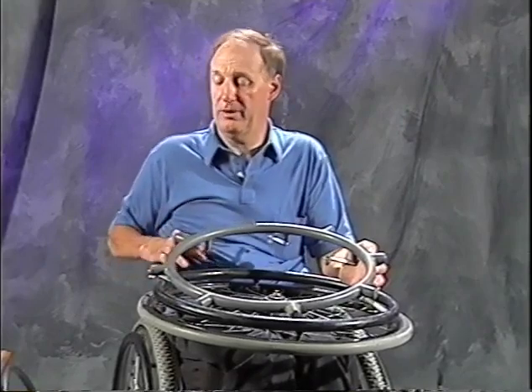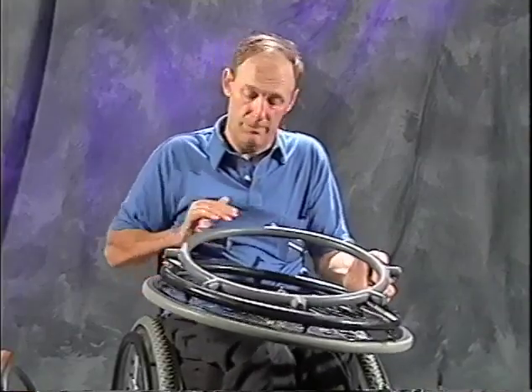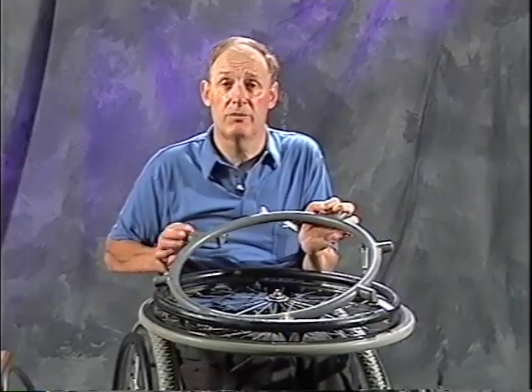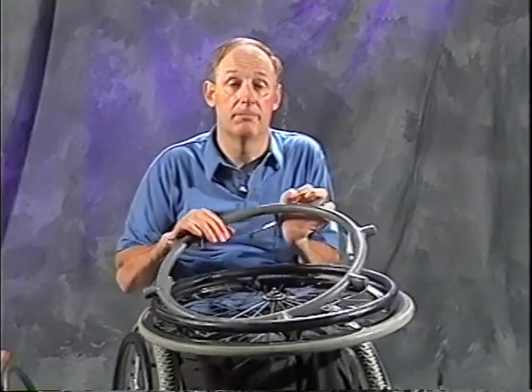One of the good points about this hand rim is it has a plastic coating on it. You can push it just about anywhere and get some high friction. One of the bad things about it, though, is that these projections are fairly squared off, and if you push on these for a while, they'll hurt your hands. So you may want to consider something with the rubber-coated ones like we used in the film earlier today.